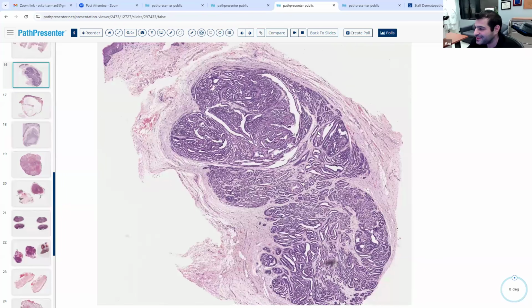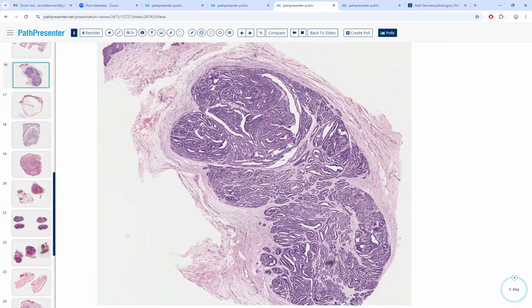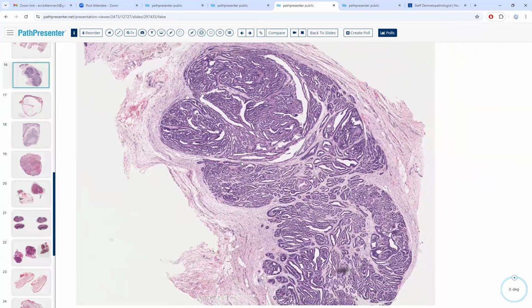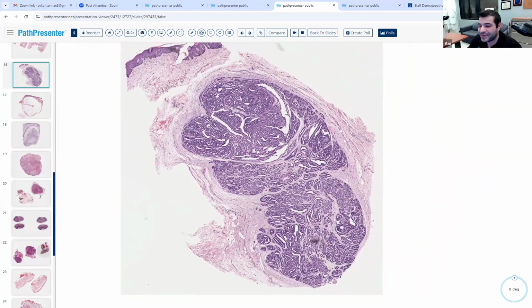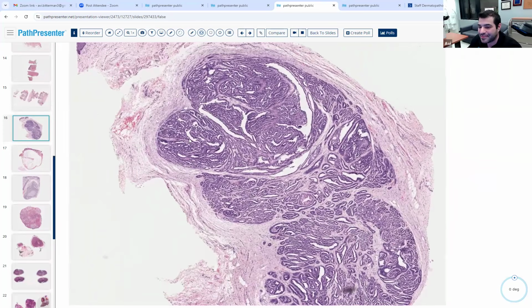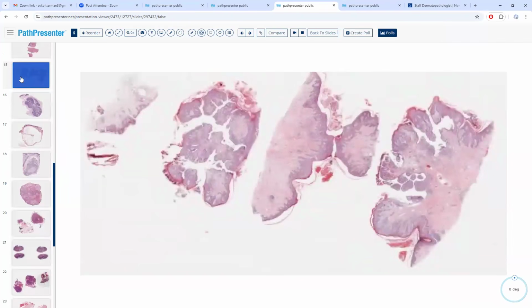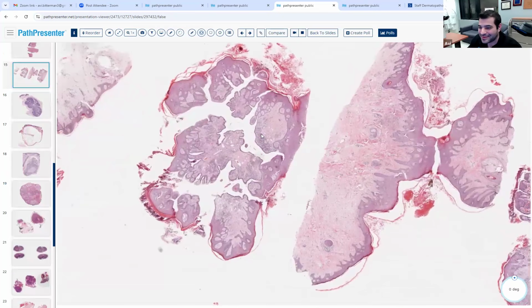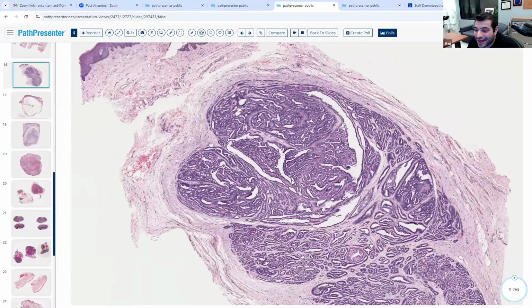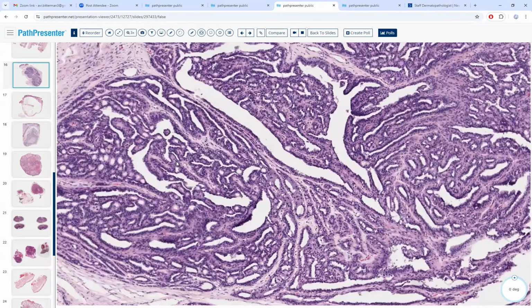Another low power diagnosis. HPAP. So is the main difference between SPAP and HPAP just whether or not it opens to the surface? HPAPs typically don't have a surface connection, and SPAPs do. This other one, you see how it has a maze-like architecture? So the old saying is SPAPs are the thing you slide in, and HPAPs are like the maze you hide in. I don't know if that's helpful, but that actually is very helpful.